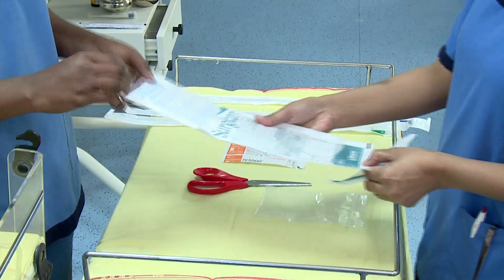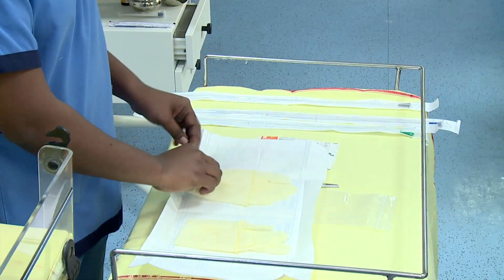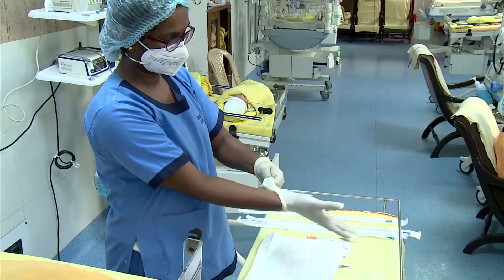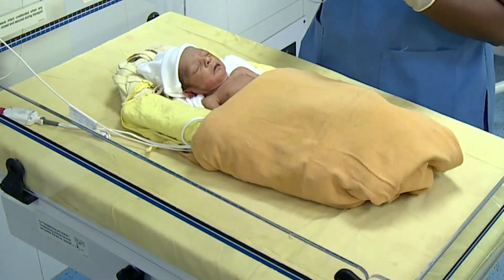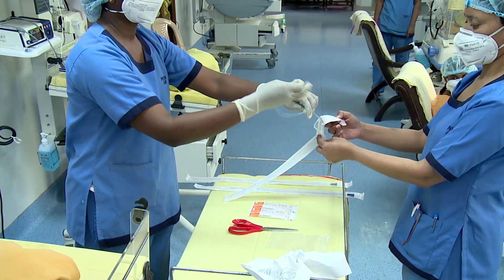Don the sterile gloves. Place the baby in supine position. Select and open an appropriate sized feeding tube.